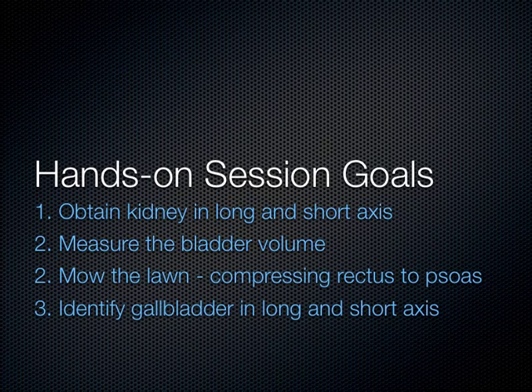Okay. Yes? Putting the right leg as far as you can over the left, why? I don't. Yeah, that's a great question. That comes up all the time. Why would you put the right leg over the left leg? I think it has an effect on the psoas muscle, brings the psoas muscle maybe a little bit more anteriorly. That's one of the things I can think.